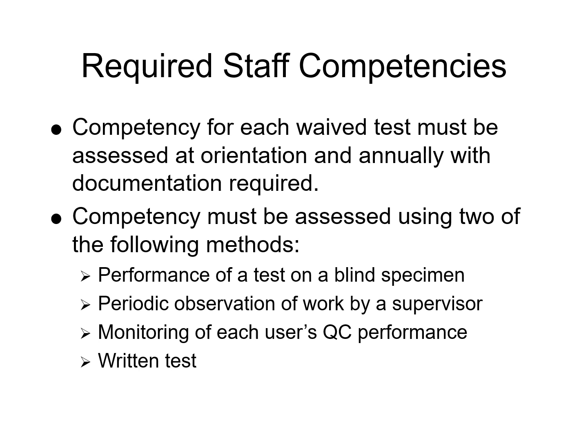So, required staff competencies. These competencies must be assessed at orientation, before the employee starts performing any waived test by themselves, and then annually thereafter. We must have documentation of this assessment, and this is required for each evaluation. There are different methods of competency assessment, so the competency must be evaluated using 2 or more of the following methods.